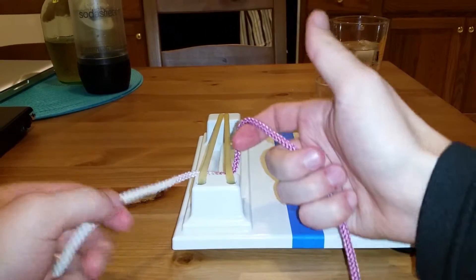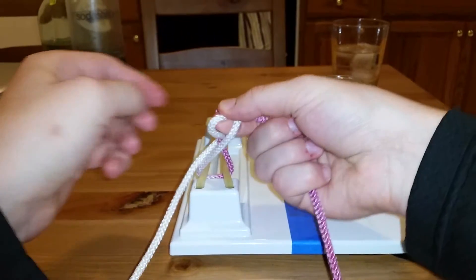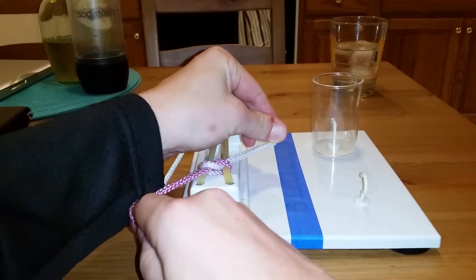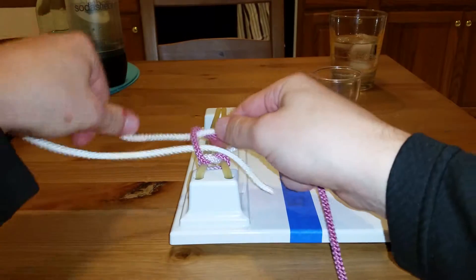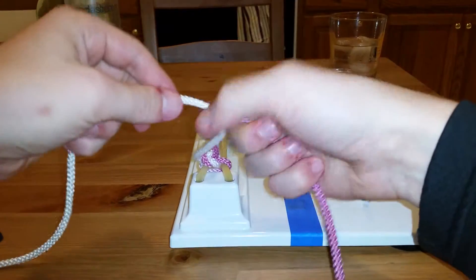We're going to start with the right hand as the business hand. Index finger wrap it around, bird's beak through, grab, come back. We're going to wrap the left hand around the right hand because the right hand is the business hand that sets up for the second throw, which is the same thing but reverse — the thumb is making the bird's beak this time. Come back through, lay it down flat, nice and tight. That was our first knot.